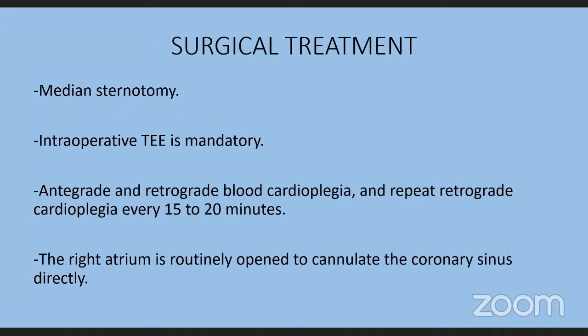So the surgical treatment starts with the median sternotomy. Intraoperative TEE is mandatory to evaluate the valve. Patients who need emergency or urgent surgery are often sick, with congestive heart failure symptoms and signs. For that, it is important to have good myocardial protection. So we're going to use antegrade and retrograde blood cardioplegia and repeat retrograde cardioplegia every 15 to 20 minutes. The right atrium is routinely opened and the coronary sinus cannulated for the retrograde cardioplegia.